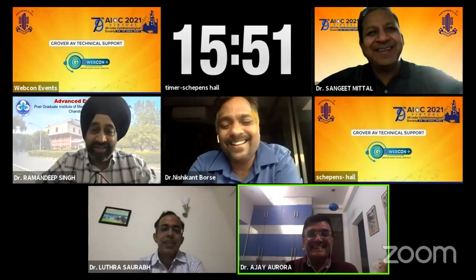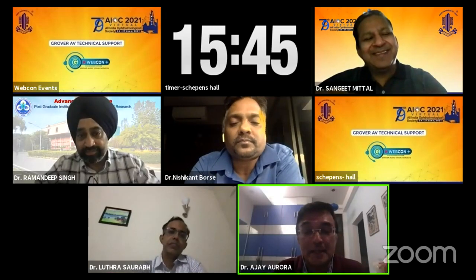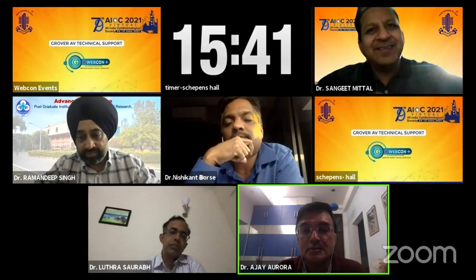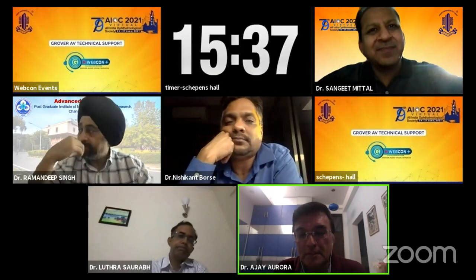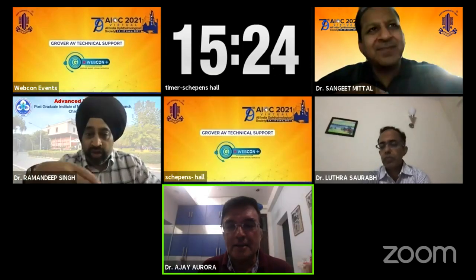Any incidents of suprachoroidal hemorrhage, Dr. Ajay, in your device? No, not a single one. That's surprising. I was worried about suprachoroidal hemorrhage, but surprisingly not a single one. The only thing I am worried about is the study from PGI where they used Tricot and they had fungal endophthalmitis. That's my worry. I think you have to take care of the sterility of the Tricot. That is not in your hands.